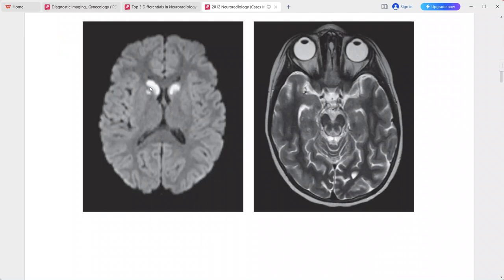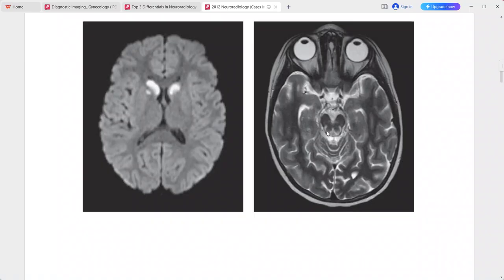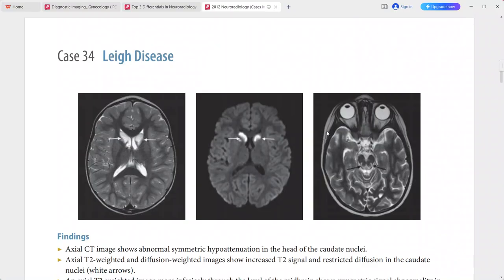Axial T2-weighted MRI at the level of the midbrain shows symmetric signal abnormality in the dorsal and lateral midbrain. This is a case of Leigh disease, and the differential includes hypoxic-ischemic injury.